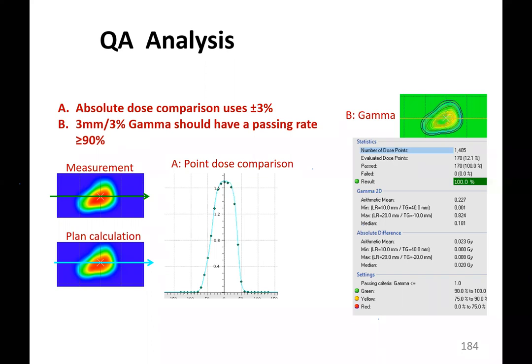And secondly, sir, another quick question from my side regarding the contouring protocols. The way the uncertainties you have shown us is totally different from the AAPM report. So the contouring protocols are completely changed because of these uncertainties? Yeah, as I showed you in the past, we are using ICRU 78, which tells how much margin we need to give to the GTV for the proton. Particularly for protons, PTCOG is also very active in order to do the contouring. Okay.